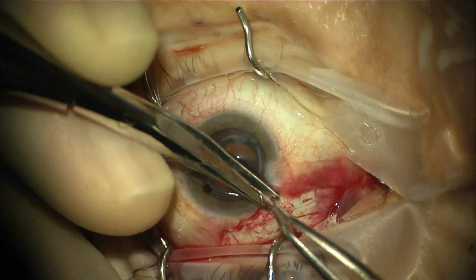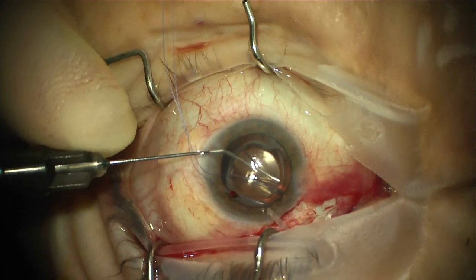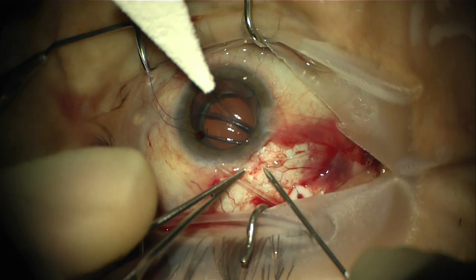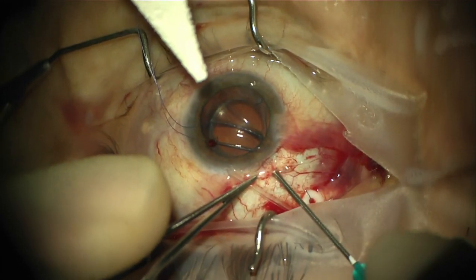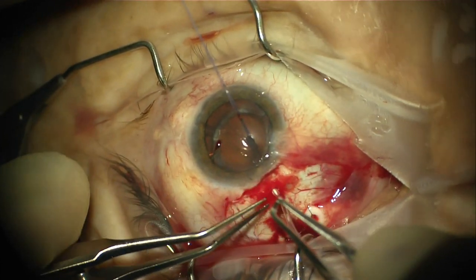The tube is then trimmed in the usual fashion with a posterior bevel for sulcus placement. The sulcus is deepened with viscoelastic. A 23 gauge needle, which actually comes packaged with this device, is used to make a needle sclerostomy into the desired location.